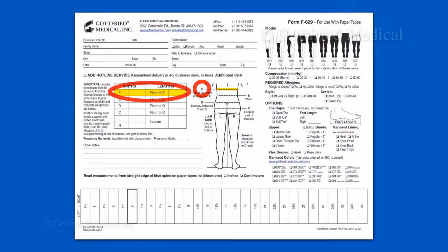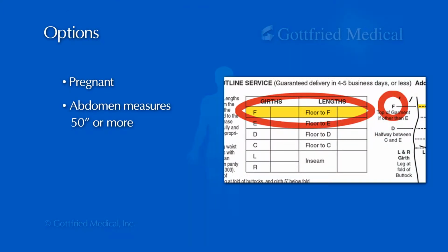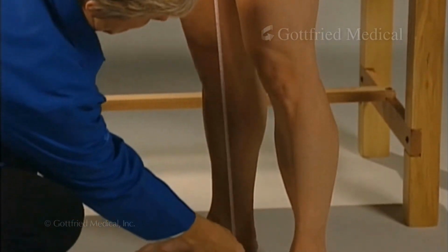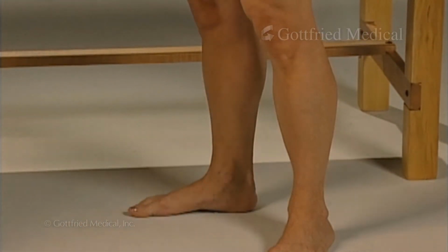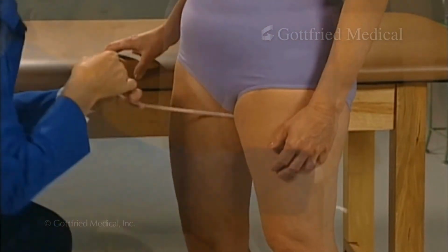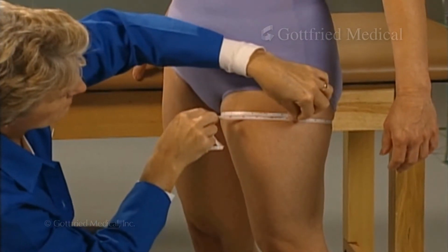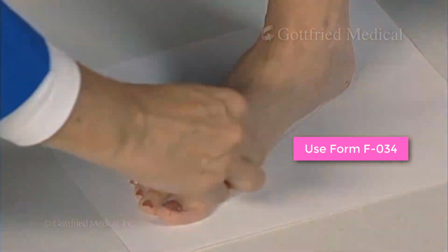Measure girth and length at point F if the patient or customer is pregnant or has an abdomen measuring 50 inches or more, or if a support extending above the waist is desired. Next, measure and record the inseam from the floor to the groin. This measurement is needed to determine the leg length of the support. Measure and record points L and R, the girth at the top of each leg at the fold of the buttock. Finally, remember to include foot length.